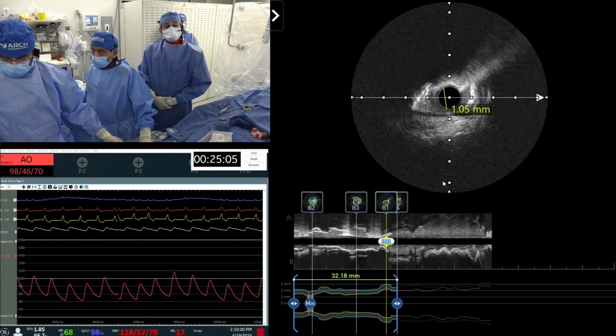And I would say that absolutely I agree with your statement. Had we known that the IVUS catheter did not pass, we would have clearly done that. But since we have the 1.75 open already, we went. But you are right. Absolutely, this is the case when you have trouble passing the IVUS catheter. If you cannot pass, you go with 1.25. We did 3/4 passing of the IVUS catheter, so it should be a 1.5 burr, not 1.75.